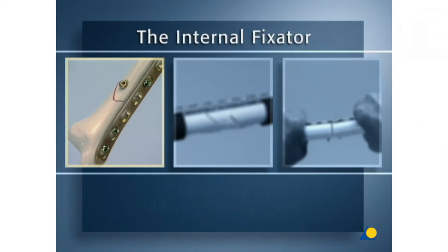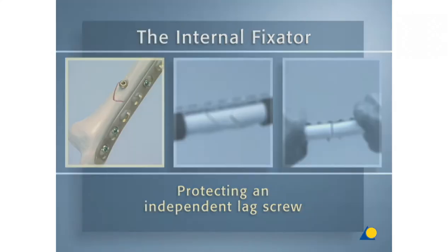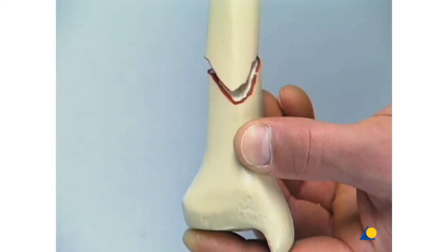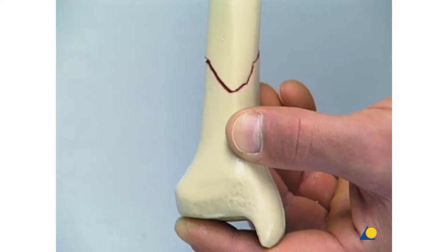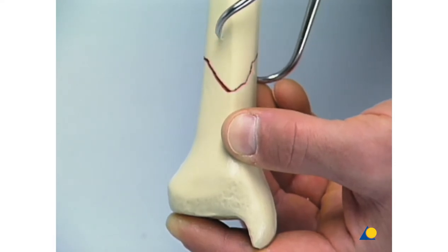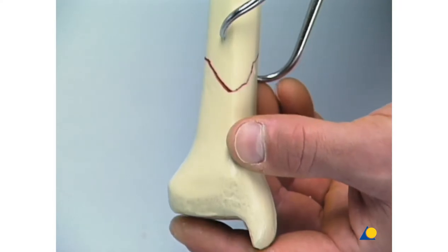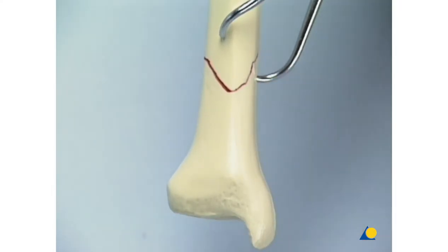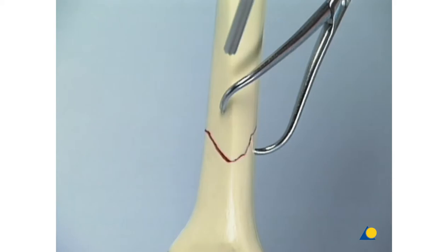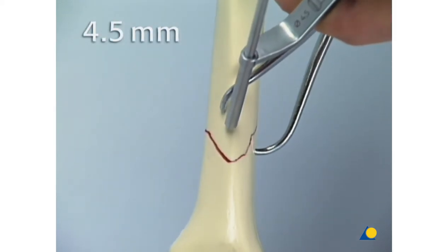First, the internal fixator protecting an independent lag screw, which provides absolute stability. The short oblique distal tibia fracture is anatomically reduced and held with the pointed reduction forceps. As the first step, a 4.5 millimeter lag screw is inserted in the AP direction.